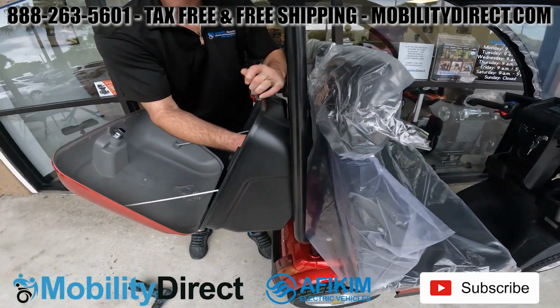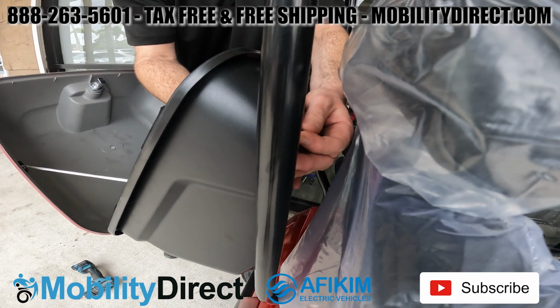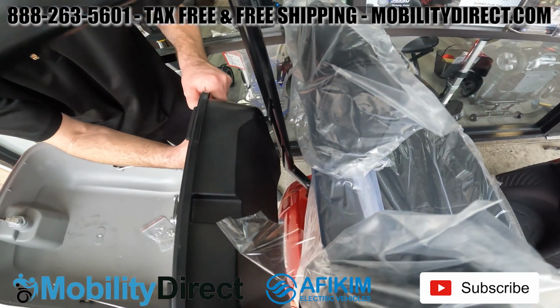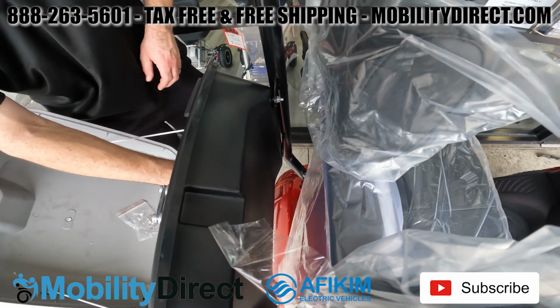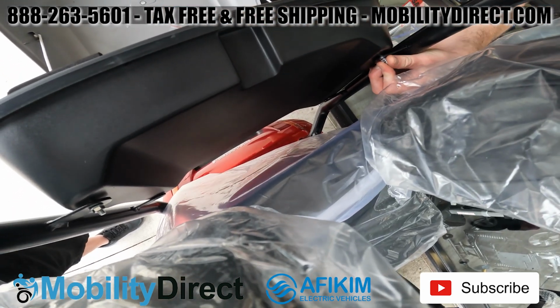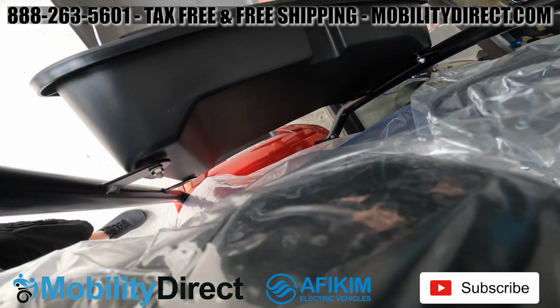So you fish that bolt through first and then get the nuts on, just using your hand strength at first. If you just get one on, it makes it a lot easier to work on the other one. I would start with the top, get those nuts and bolts secured, and then come back after you get all 4 of them secured with just your hand strength, and possibly use a drill or some other tool to make sure that you tighten them all the way.